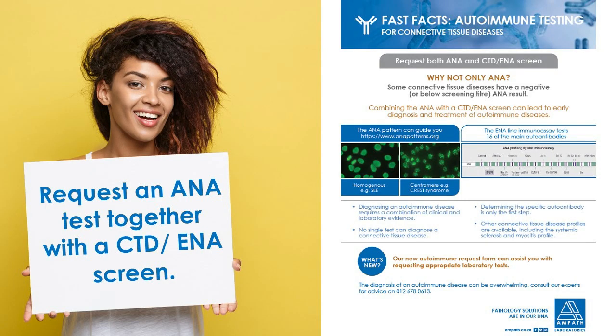Because ANA patterns are not disease-specific, further testing for disease-associated autoantibodies needs to be done. Other reasons that underscore additional testing include the fact that cases of SLE and related disorders may have ANA titers below 1 in 80, and some connective tissue diseases have no ANA but rather cytoplasmic antibodies.